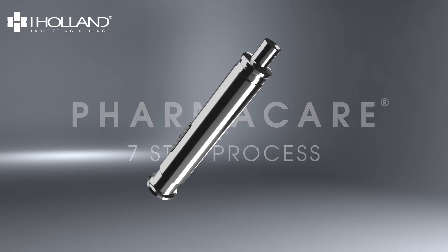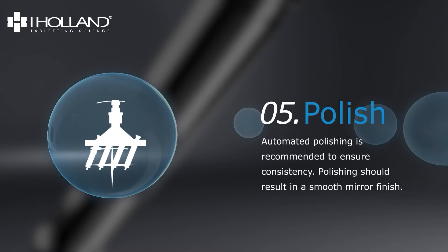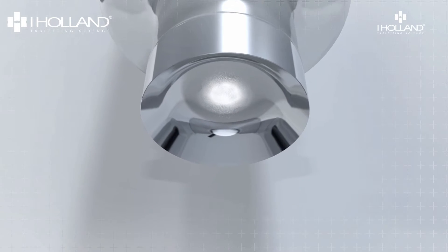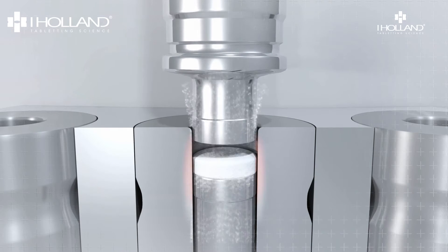Polishing your tools can have a host of benefits and is the fifth step in iHolland's PharmaCare seven-step maintenance program. In this step we are referring to the process that results in your tooling having a smooth mirror finish. This can help prevent problems like sticking by restoring the optimum finish and repairing small amounts of damage and abrasion that may have occurred during the production process.